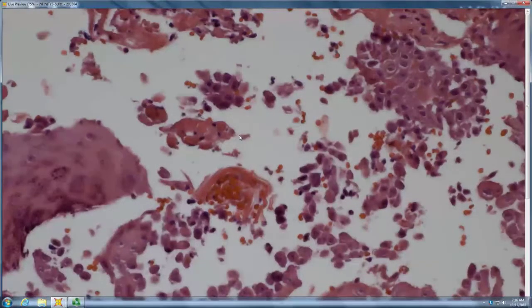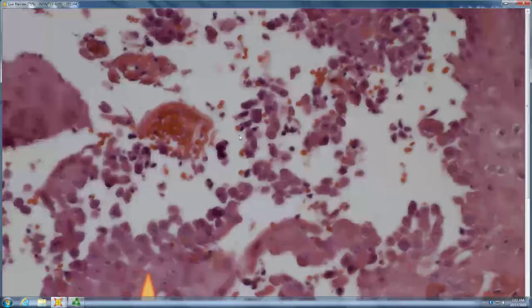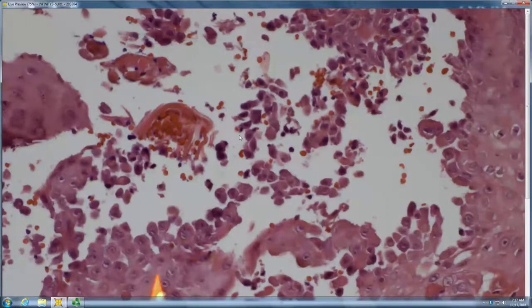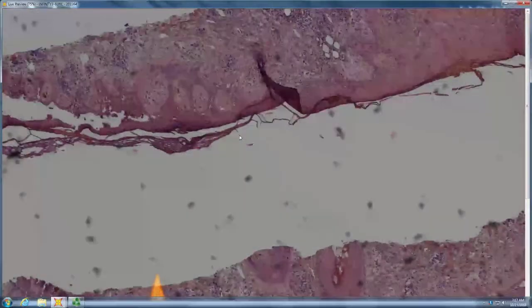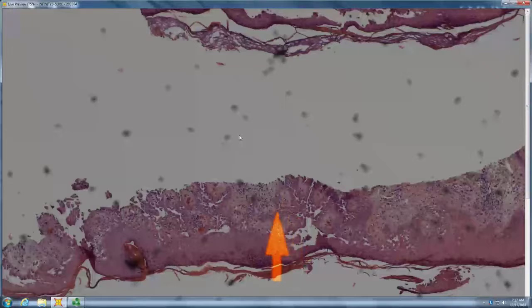So characteristic of Hailey-Hailey disease is that you have full thickness acantholysis and dyskeratosis, but only ever with red rings around the nucleus. Never clear, never blue, as you would get in other acantholytic dyskeratotic disorders. You can see in areas where it's forming villi, and it comes by its name, benign familial pemphigus, because it can really mimic a pemphigus split in some areas.